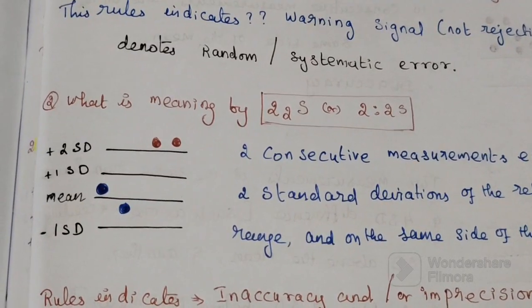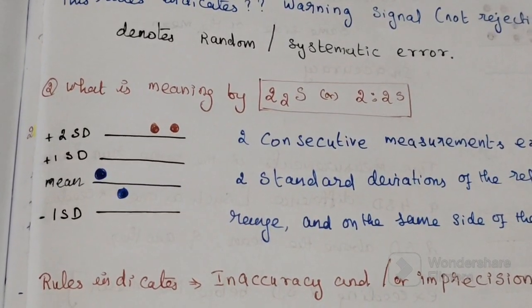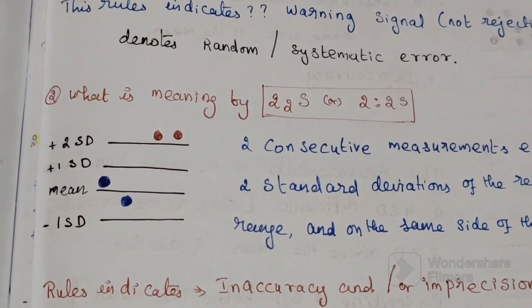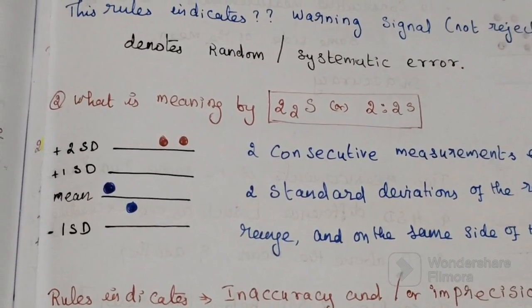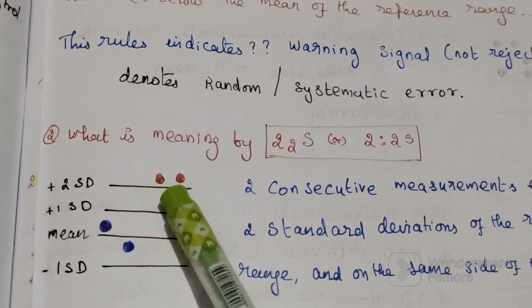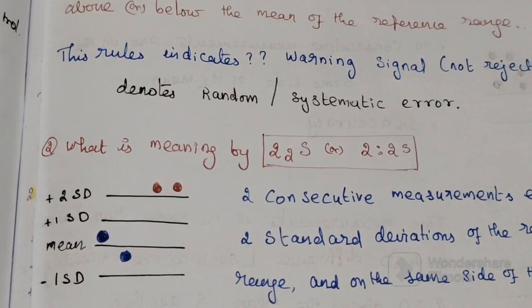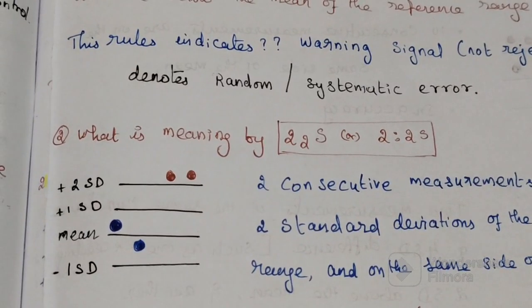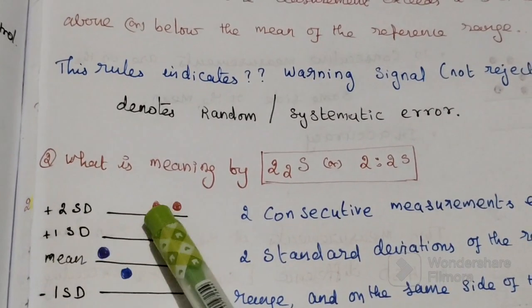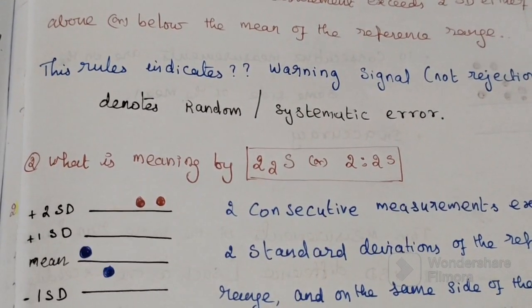Daily we have to run quality control material, that is normal quality control material and abnormal quality control material. So across run means, for example, on day 4 you got one value which exceeds plus 2 standard deviation, and on day 5 again you get a value that exceeds plus 2 standard deviation. So 2 values exceed 2 standard deviation. So this is the 2 2s rule. It is across run.